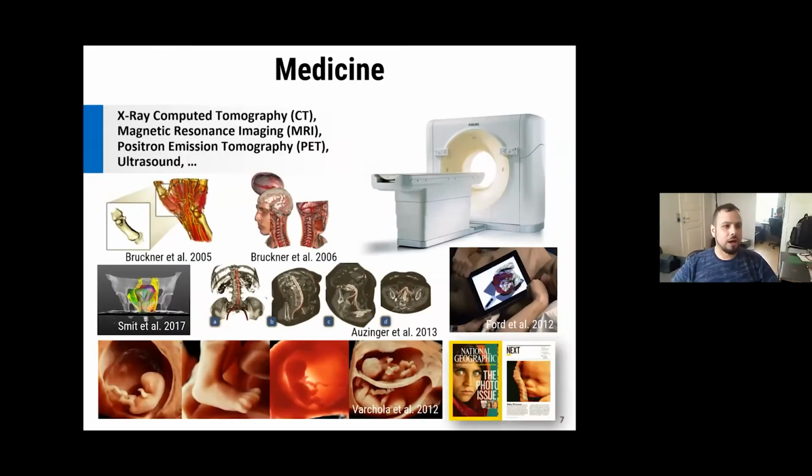So in medicine, for instance, we have multiple imaging modalities that produce volumetric data: X-ray, computed tomography, magnetic resonance imaging, but also so-called functional modalities that give us information about the physiology, such as positron emission tomography, and even live modalities such as 3D ultrasound, where you are actually creating 4D data in a sense, because we are creating 3D data at many frames per second nowadays.